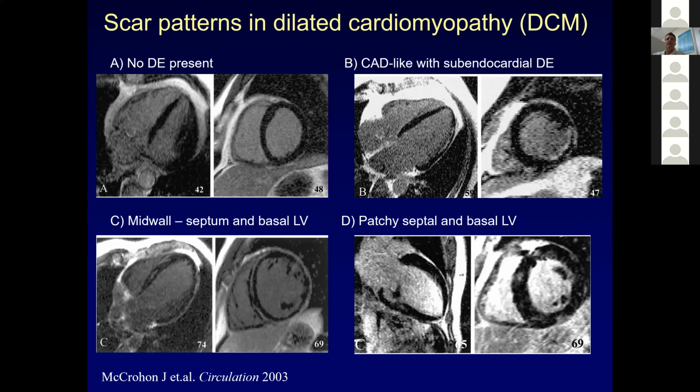Maybe we can identify scar differently with MRI. Delayed enhancement. I know the Northwestern group a long time ago, I think in the early 2000s, really described the utility of late gadolinium enhancement to describe scar. And there are different scar patterns for different disease patterns.